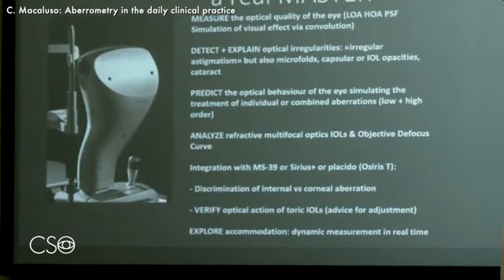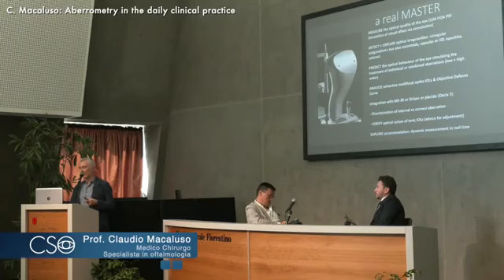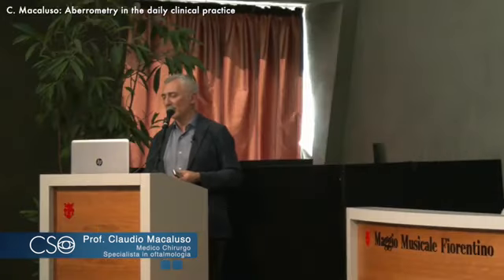He couldn't anymore. So, in conclusion, the Osiris is to me a real master. It can help us understand many things and make decisions.